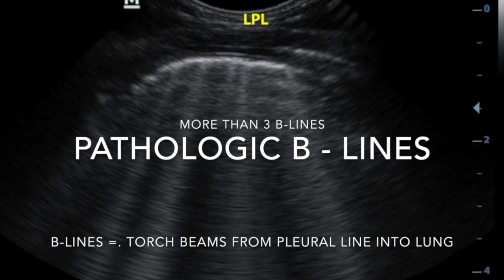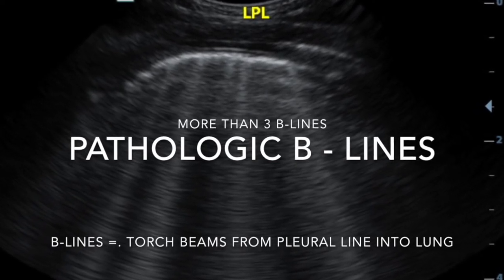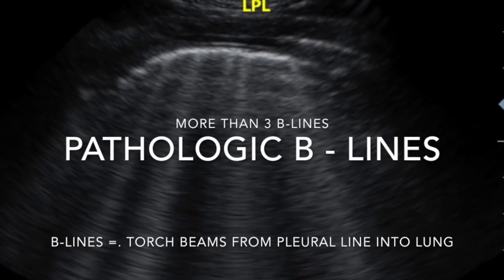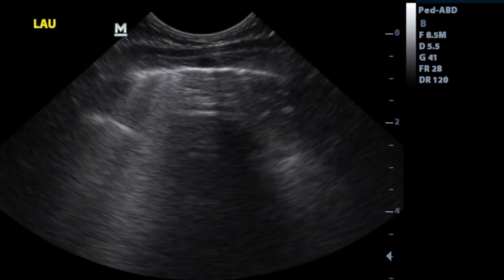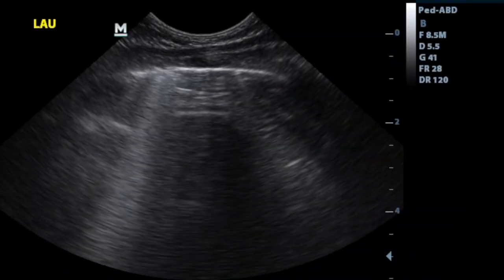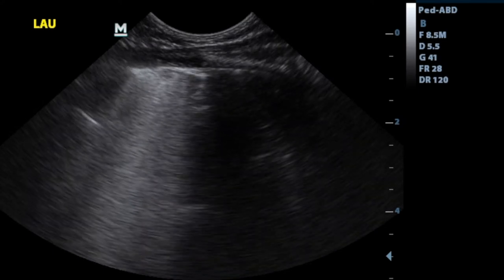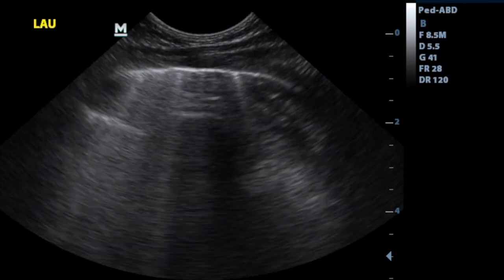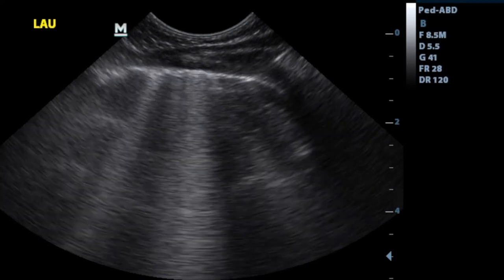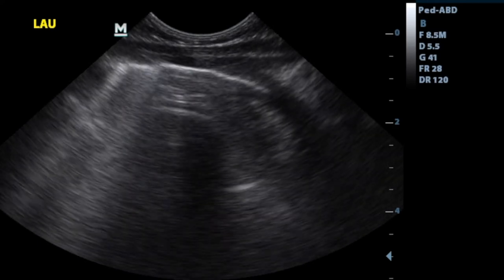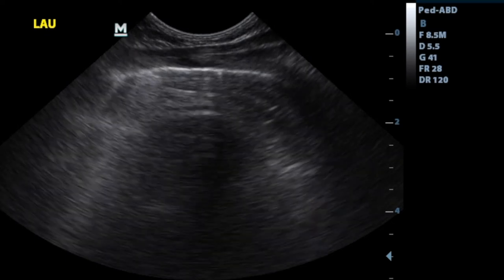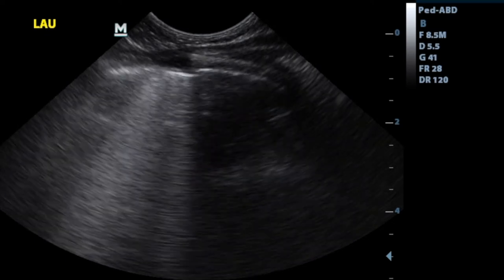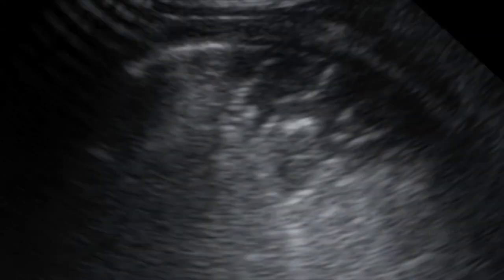B lines are torch-like white shadows starting at the pleural surface. They are only important if there are many of them — more than three B lines, or more than three torches shining from the pleural line, are pathological. You can see here that a lot of the B lines are confluencing; we call this a compound B line. The importance of B lines is still debatable but they probably represent interstitial thickening such as occurs with interstitial fluid or pneumonia.